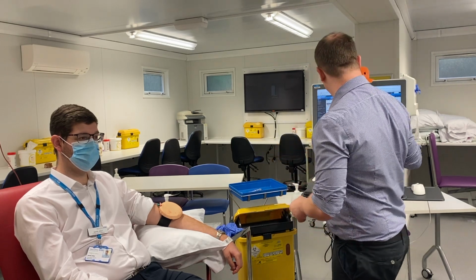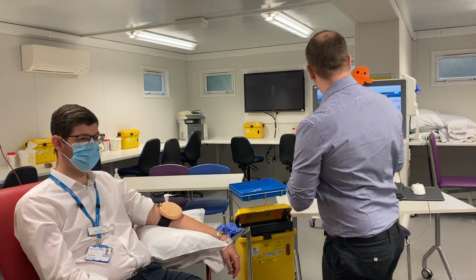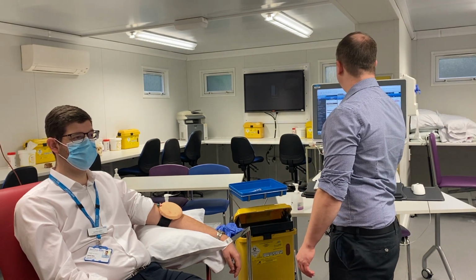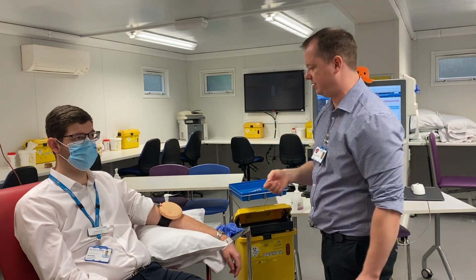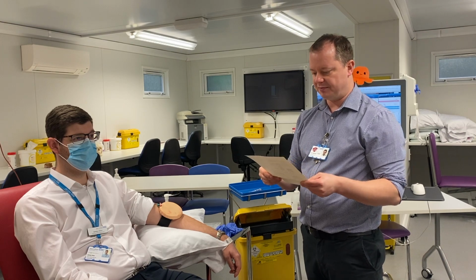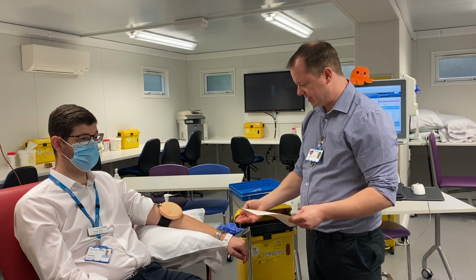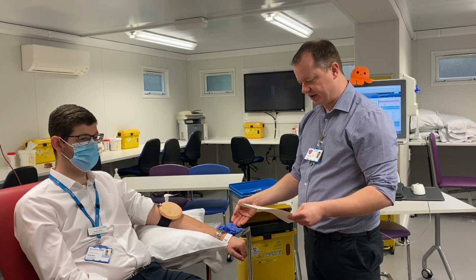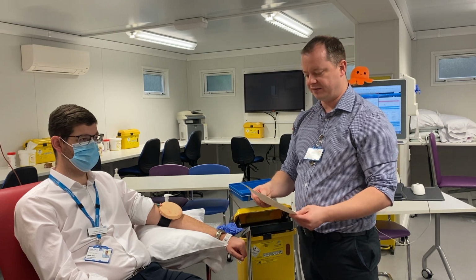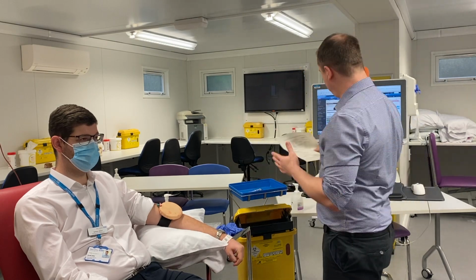For standard blood tests, the visual check is going to be using the scanner, scanning the wristband, and then we can see that the samples we need have come up. We need to take a red bottle and a brown bottle, one for haematology, one for biochemistry. But I am going to take a blue bottle as well for blood transfusion samples, so I need to visually check this form on the patient's wristband. SimDemo1, date of birth is the 1st January 1968, and the MRN or hospital number is 2016375. So this form matches this patient, and this computer matches this patient, so I'm happy to go ahead and take a blood sample.